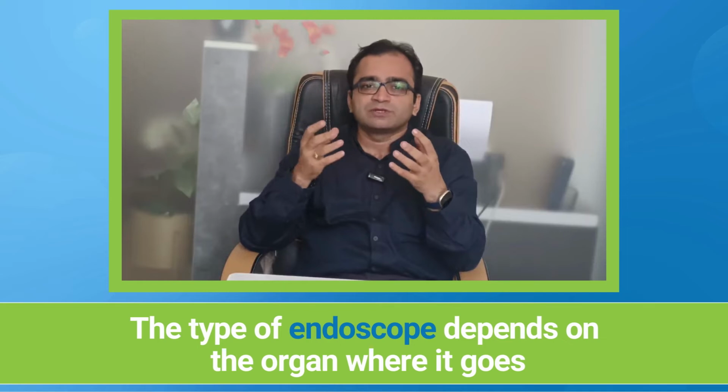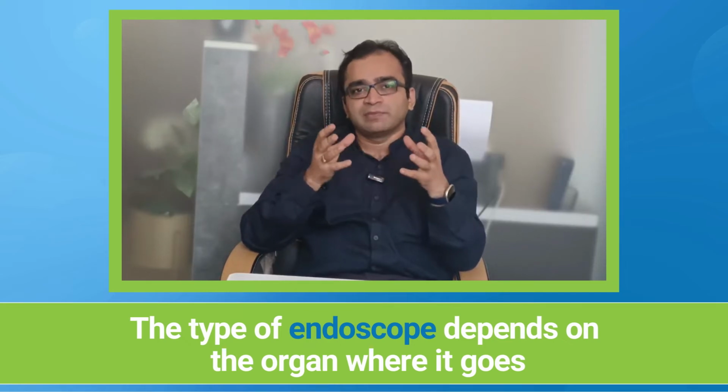And what kind of endoscopes do you have? So basically endoscopes depend on whichever organ they go into. A respiratory medicine or chest physician will have something called a bronchoscope, where you'll have a tube with a camera inside which will go inside the lungs and see what exactly is the lungs' focus.